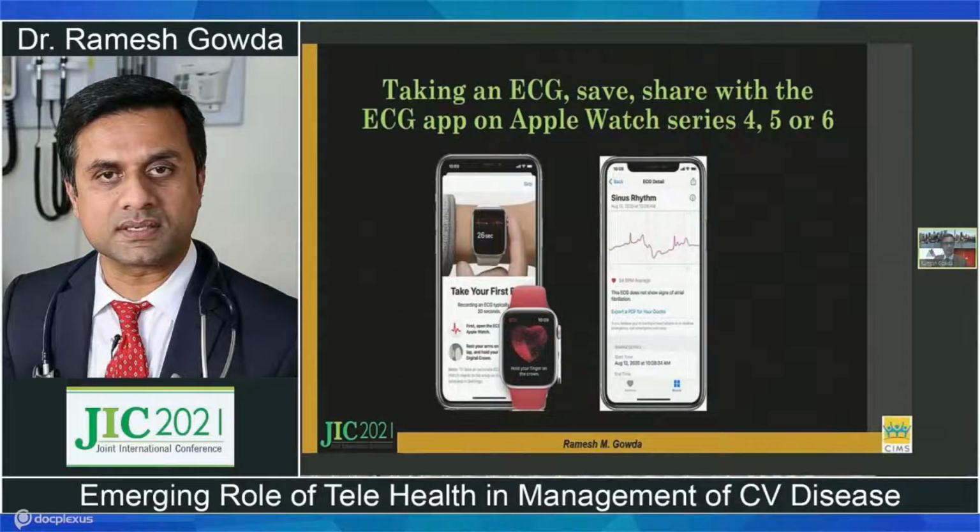So the Apple Watch Series 4, 5, and 6 can record an ECG, which is so useful. For example, a patient having chest pain, unusual symptoms, irregular heartbeat or skipped beats can take an ECG, save it, and transmit it to the physician. Recently we heard about a physician who had chest pain, was able to get an ECG and noted some changes, called EMS, went to the hospital, was found to have 3 vessel disease, and underwent an emergency CABG. So it's a useful tool, but again, it doesn't replace existing established methods; it's still an evolving technology.